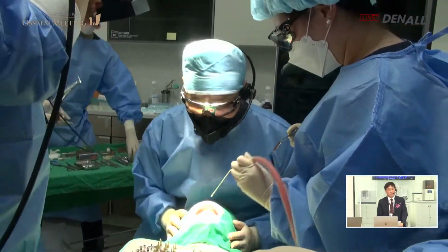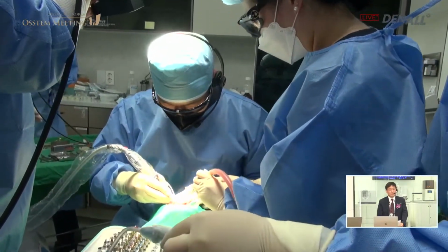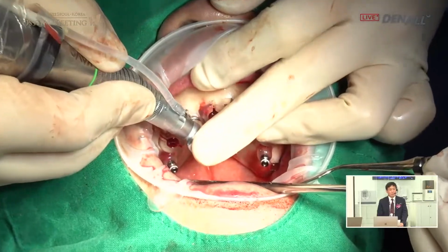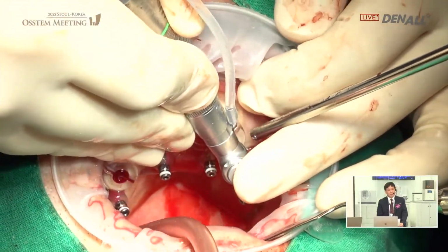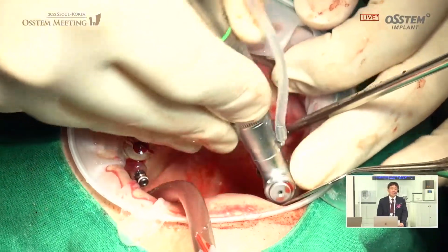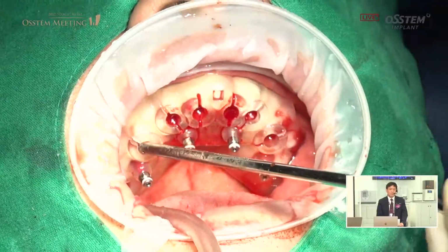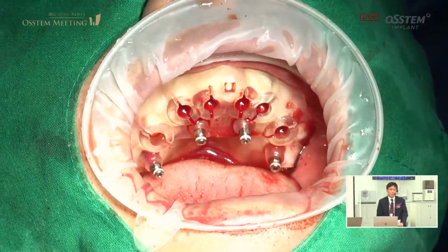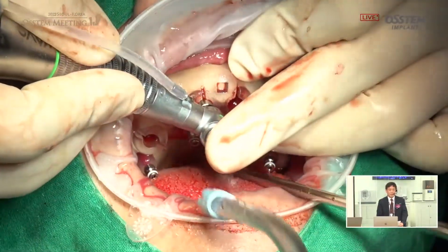So once the anesthesia kicks in, it's going to be okay. Relax a little bit. Are you okay? I think the patient is a little bit tense because it was slightly painful. Are you uncomfortable? Please tell me if you're uncomfortable.